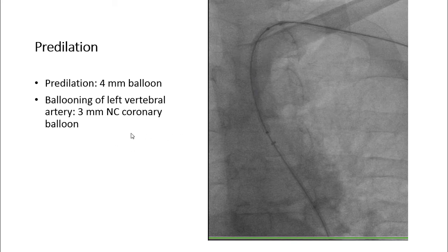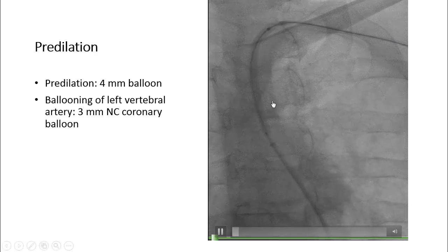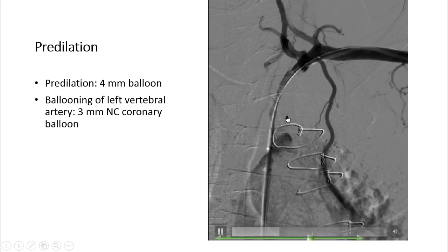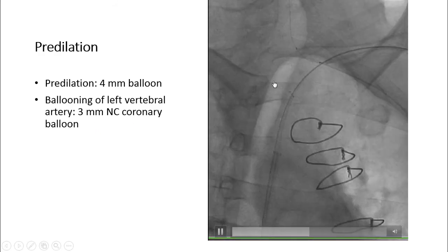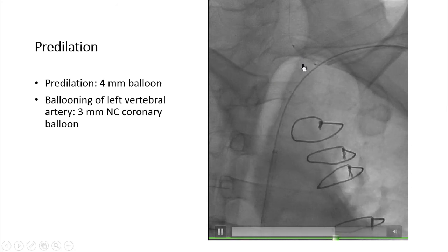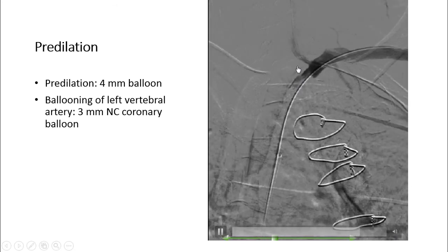We performed predilation with a 4 mm balloon. You can see the predilation of the lesion. There is also a tight lesion in the left vertebral artery at its origin, also shown on our CT angiogram, which we treated with predilation using a 3 mm coronary balloon over an 0.014 wire. You can see the 3 mm balloon in the vertebral artery and the result after ballooning.